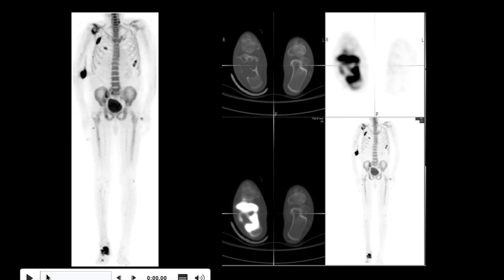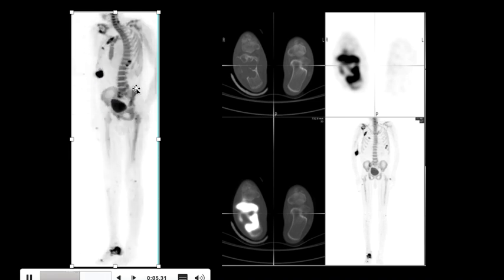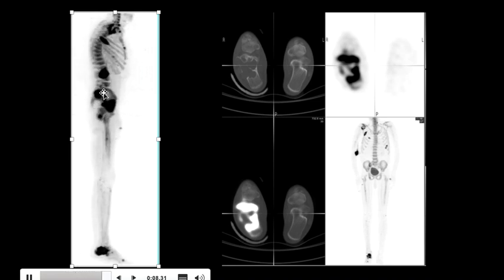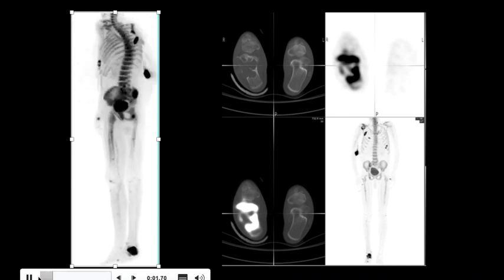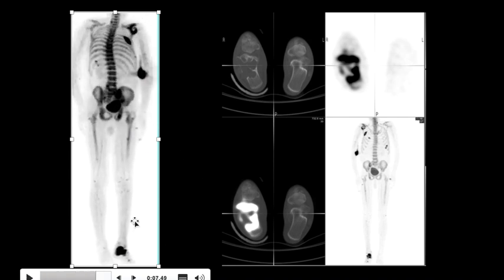Let's look at an example. Here is another patient with history of RCC — renal cell carcinoma — and we are looking at images from a sodium fluoride PET CT. We can find here faint activity in one of the kidneys, but the other kidney is absent because it has been removed for their RCC. There are multiple foci of increased uptake consistent with bone metastasis. Notably, there is a large lytic lesion involving the calcaneus on the right side showing intense linear uptake at the site of active bone turnover. This is a very rare case of calcaneal metastasis from a renal cell carcinoma, which occurred because this patient was anemic and there was active marrow up to the level of the calcaneus.